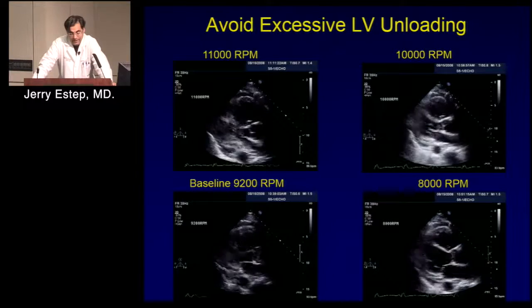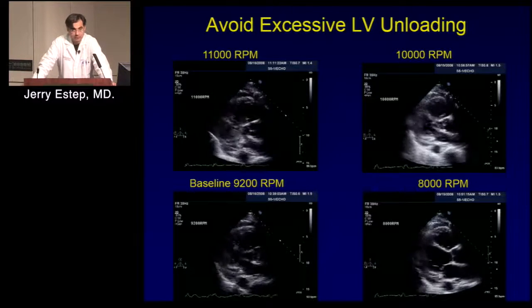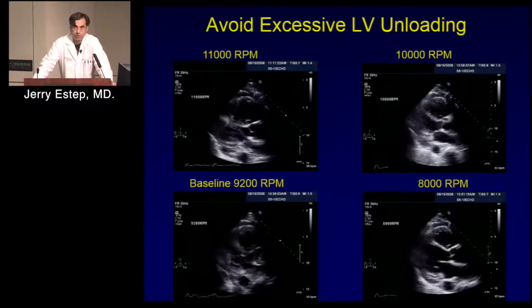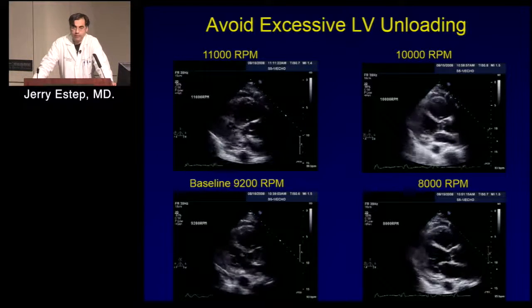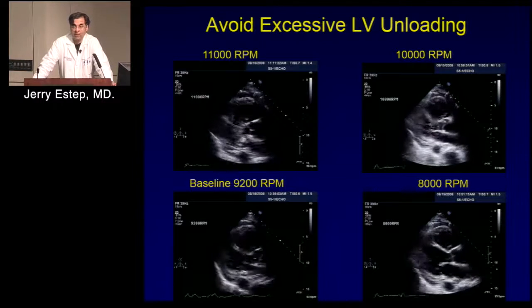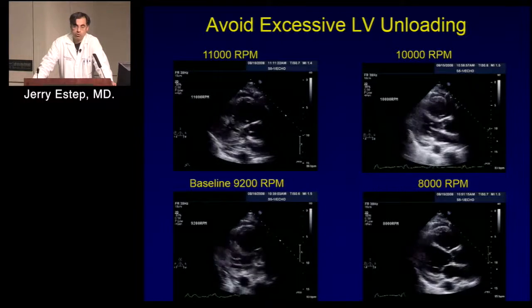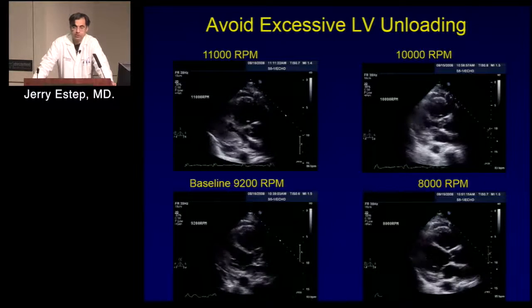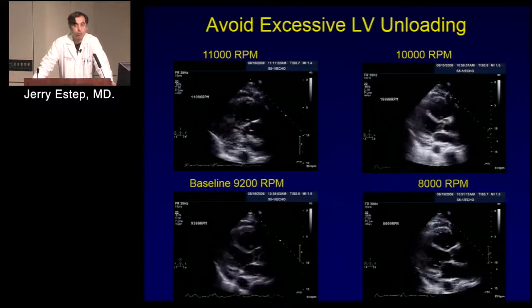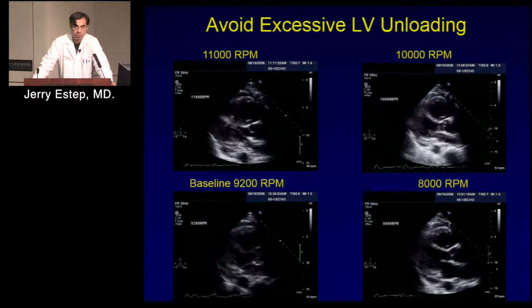Yeah, so that has a differential that's clinically meaningful, and it includes the following. Uncontrolled hypertension: afterload for the pump, and if you're augmenting pump speed, you just contribute to hypertension. And so we may not see anything. The other more concerning differential is rotor thrombus and pump malfunction. And so I'm going to show you our rule out pump malfunction protocol.